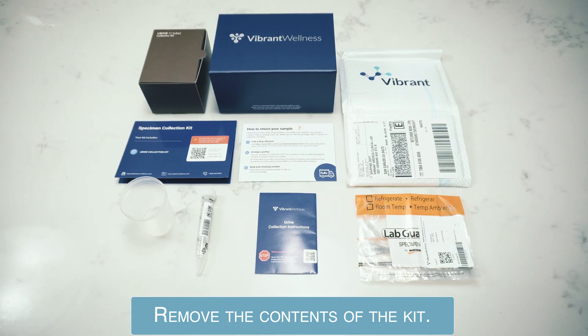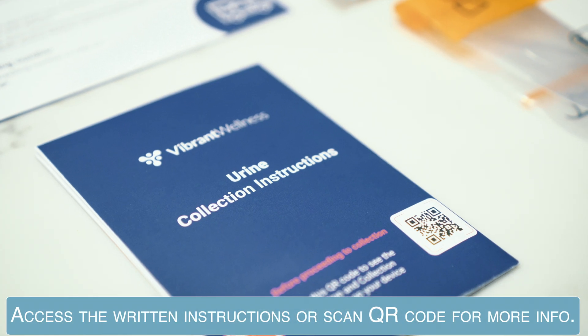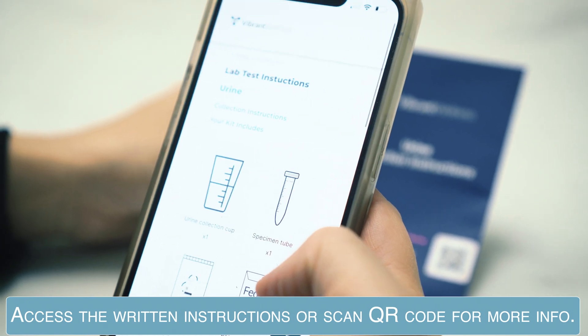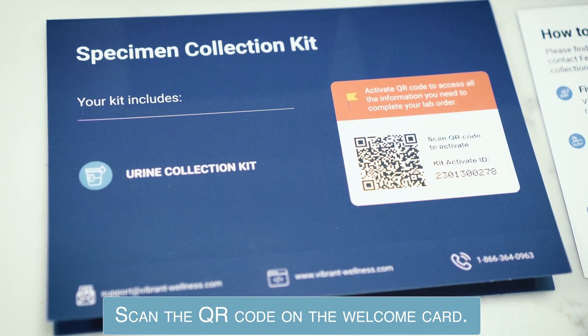Remove the contents of the kit. You will have access to written instructions and videos on how to complete your order. Scan the QR code on the welcome card.